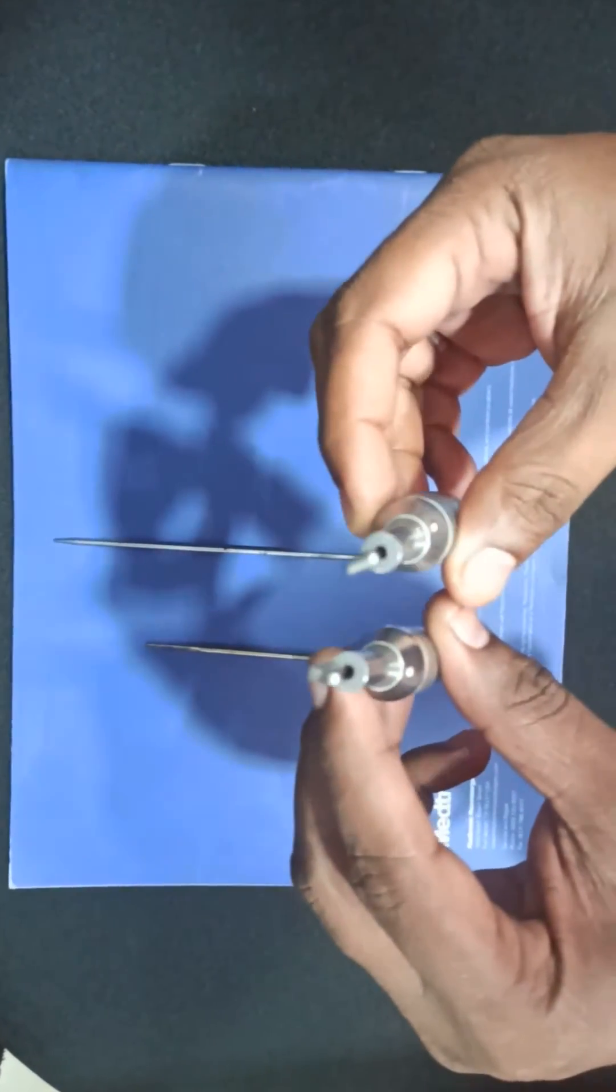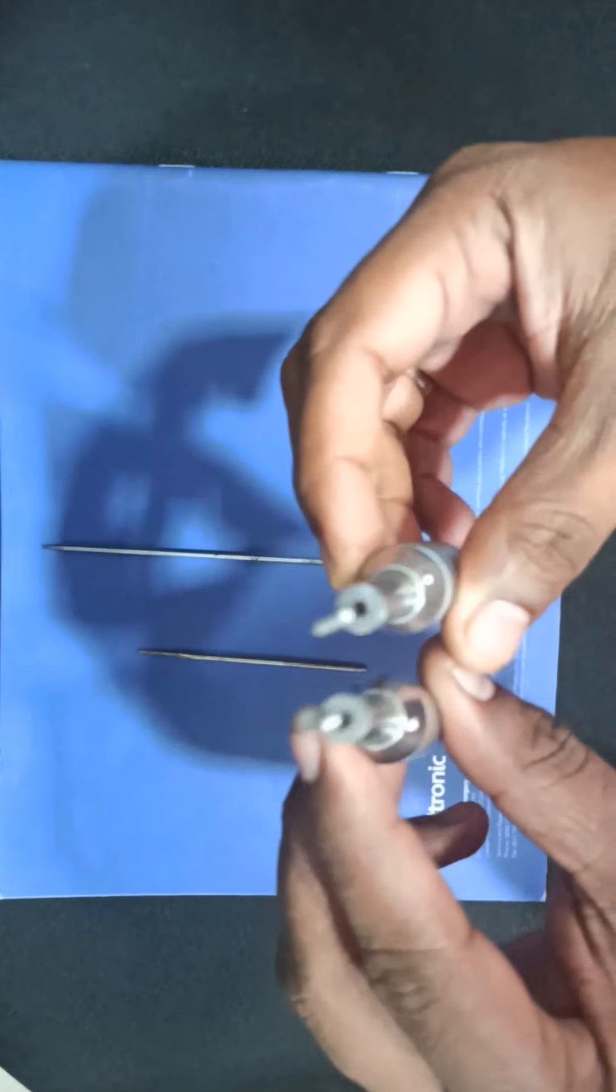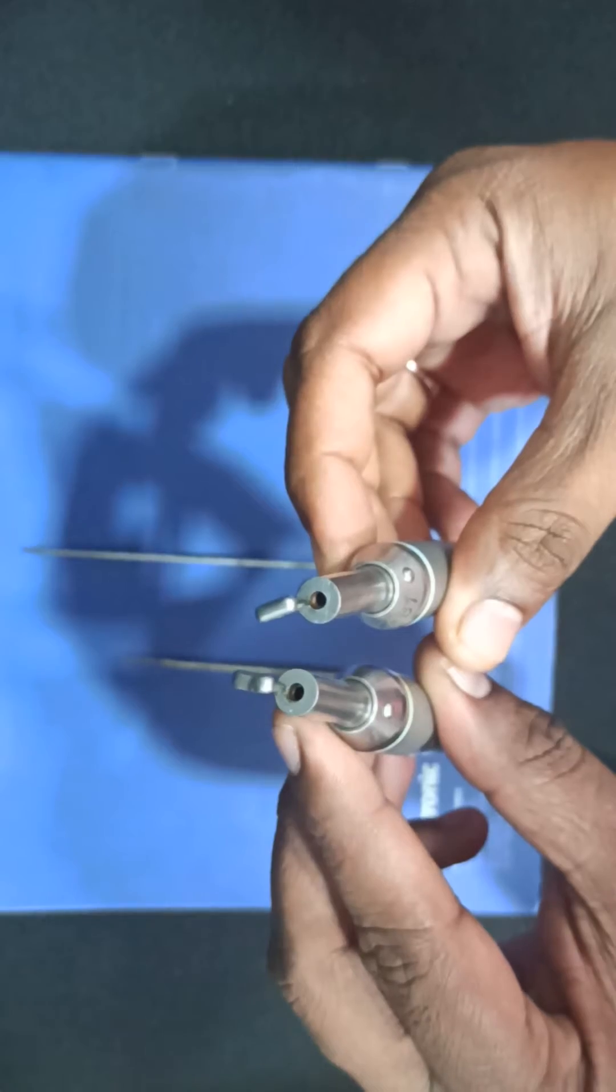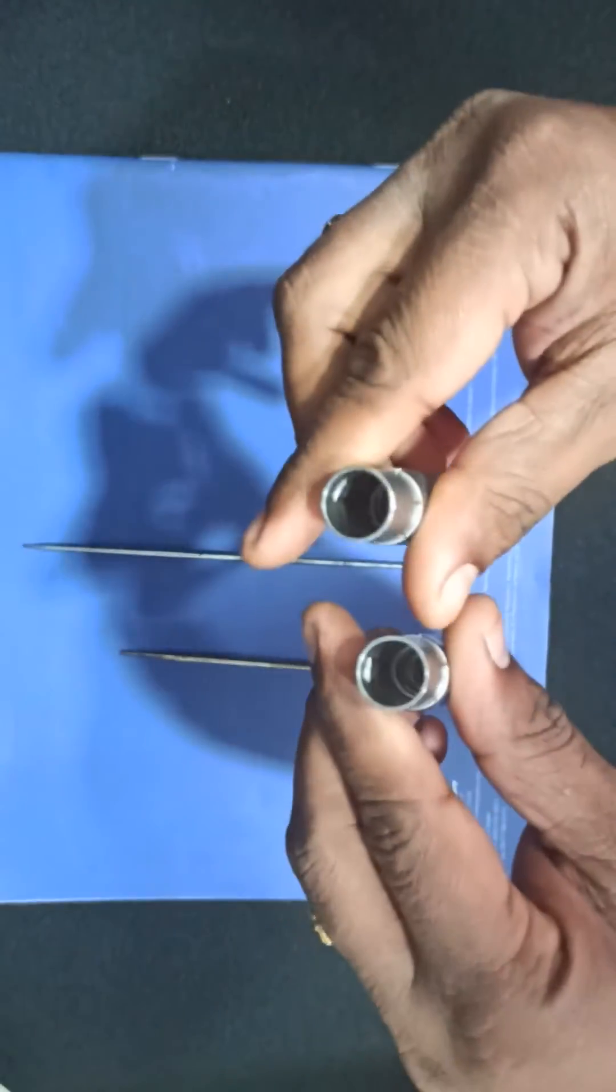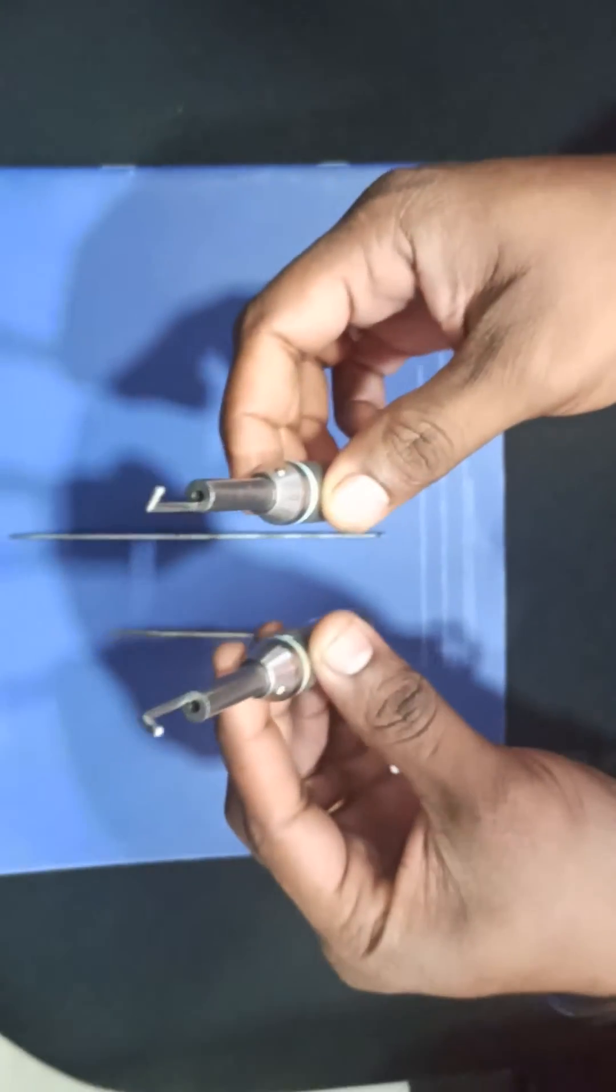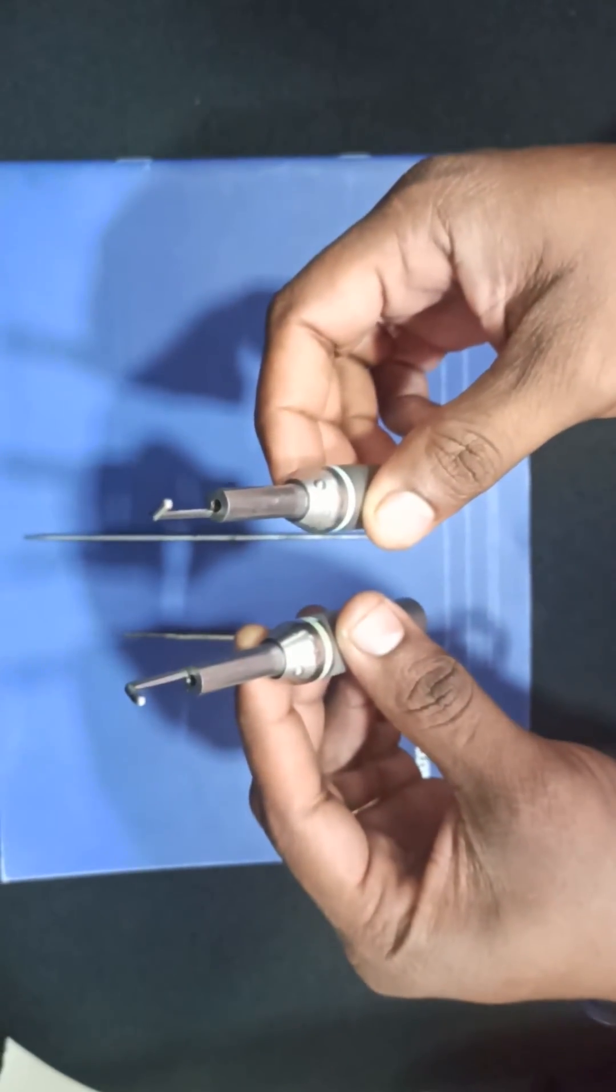When you see both attachments, you can see both holes are the same and clear. There is no damage in the bearings and everything looks clear. But how do you find which one is defective and which one is good?